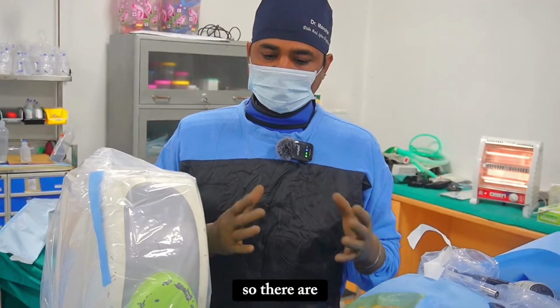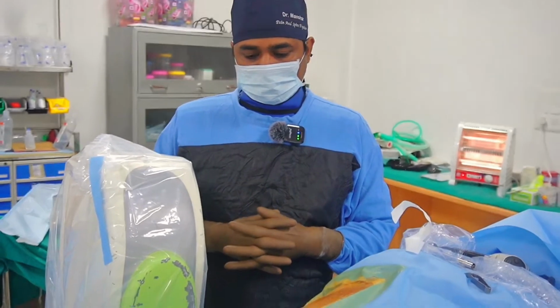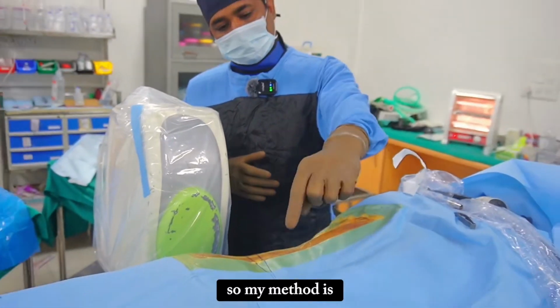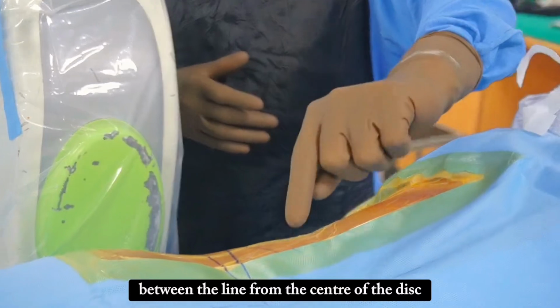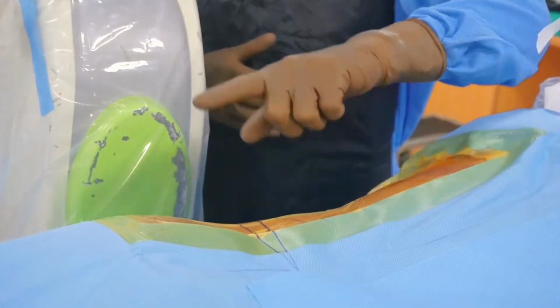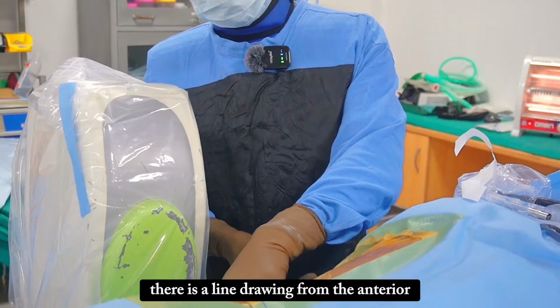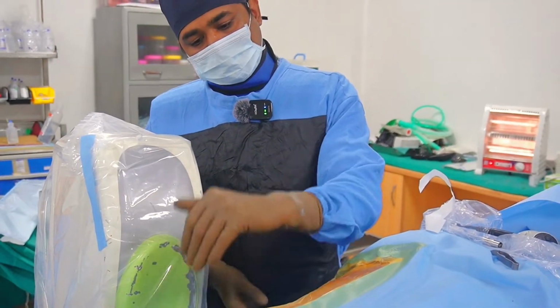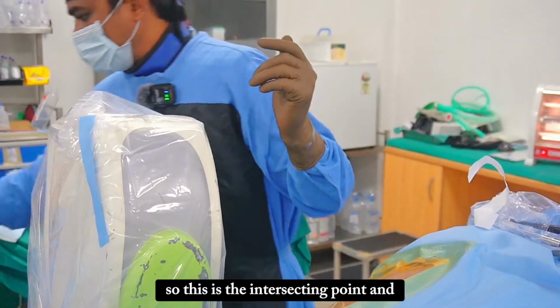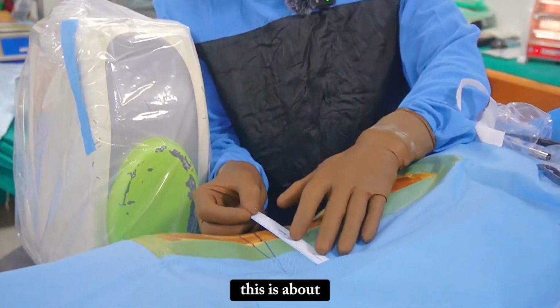So there are various methods to determine the entry of our needle to start this procedure. My method is that there is an intersection point between the line from the center of the disc, just above the iliac crest in AP view, and, in parallel, a line drawn from the anterior border of the disc parallel to the vertebral bodies. So this is the intersecting point.